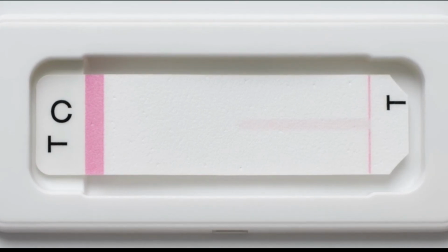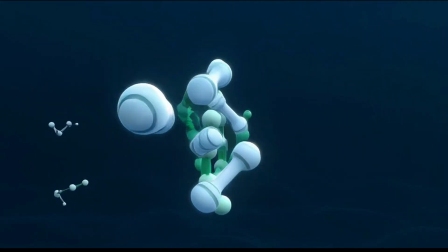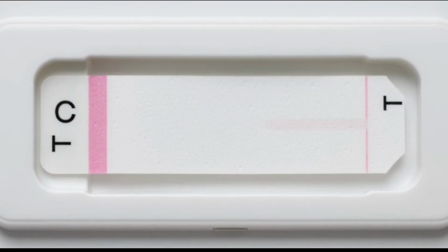But timing changes everything. A true faint positive means a small amount of HCG is present in your urine. This can happen very early in pregnancy, especially if you test before your missed period. Studies referenced by organizations like the American College of Obstetricians and Gynecologists explain that early HCG levels vary widely from person to person. So a faint line can be completely normal.